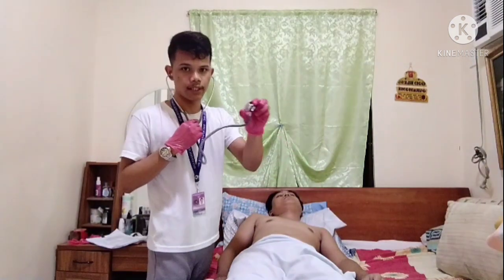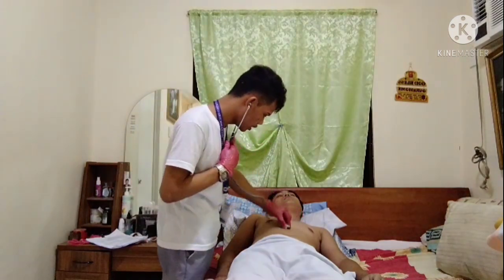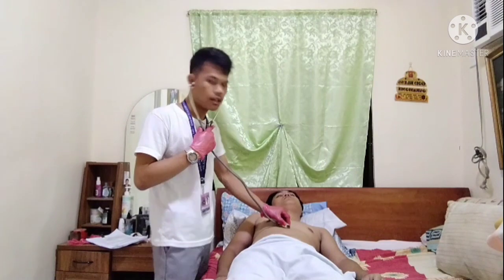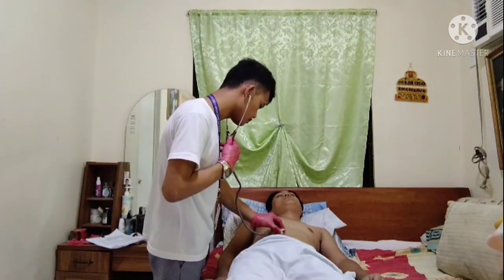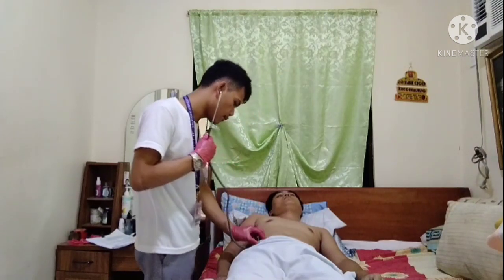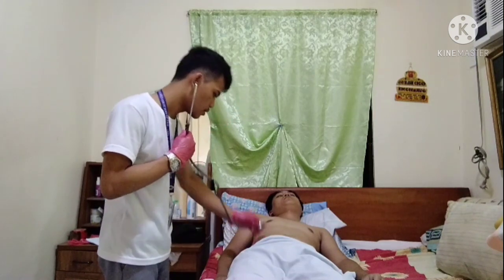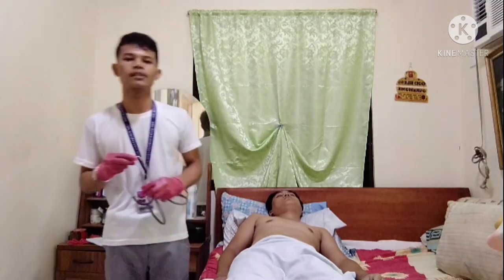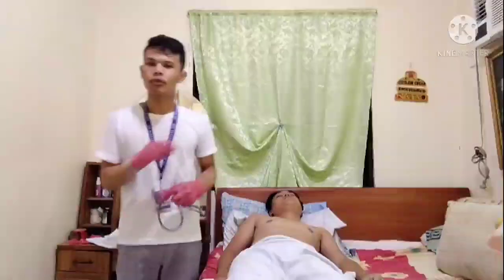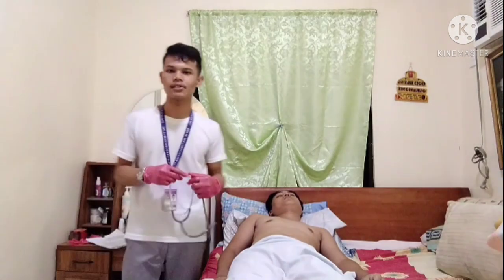Using the bell of the stethoscope, we need to start from the abdominal aorta. So here, from aorta, renal, iliac, and then femoral. Upon auscultating for the vascular sounds, I was not able to hear any bruits. So this signifies that the vascular sounds for our patient are normal.